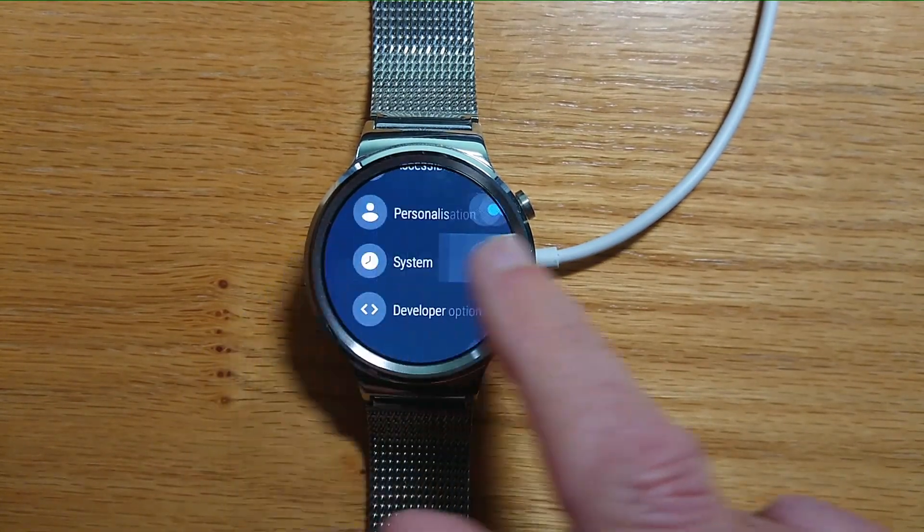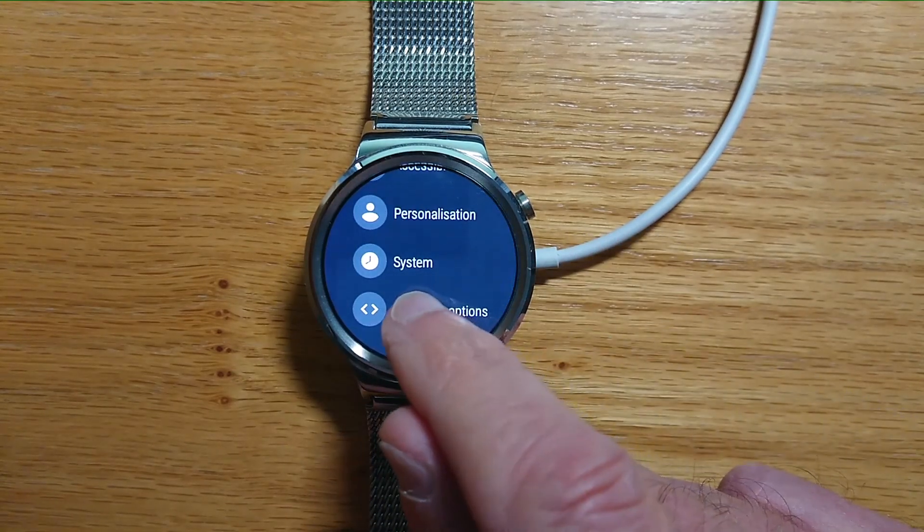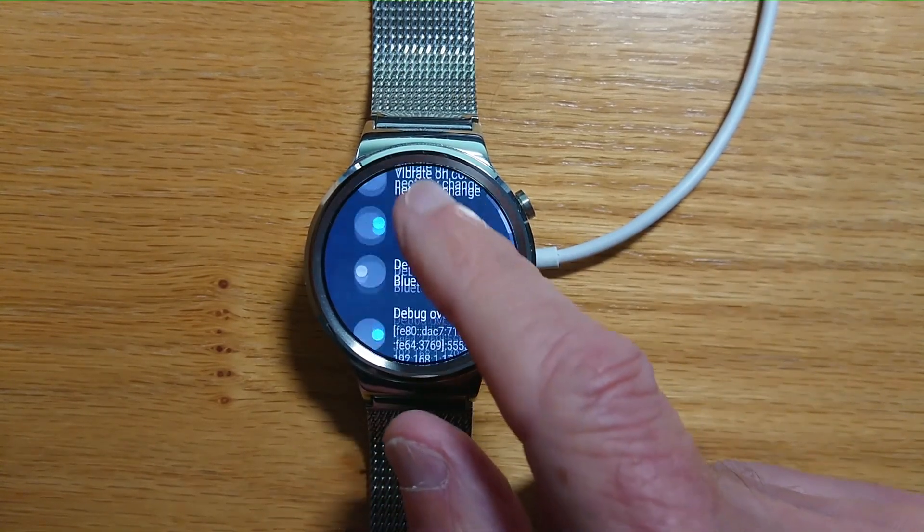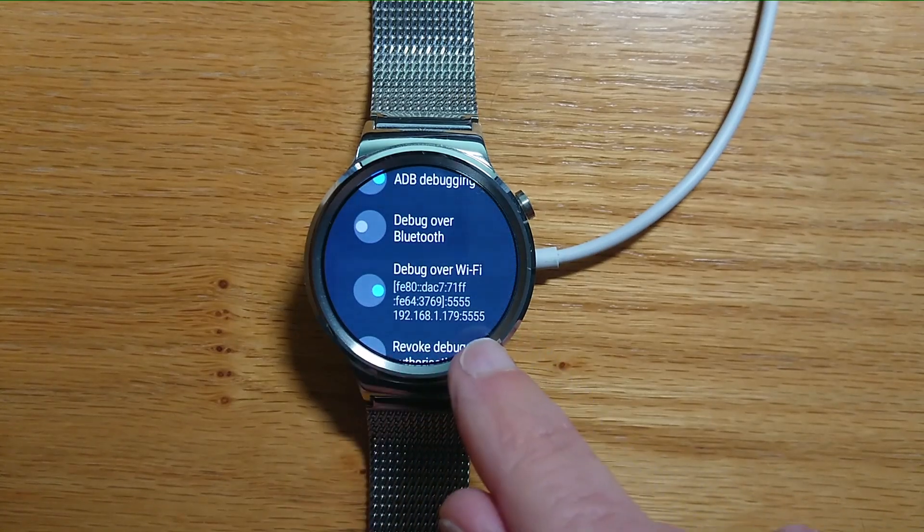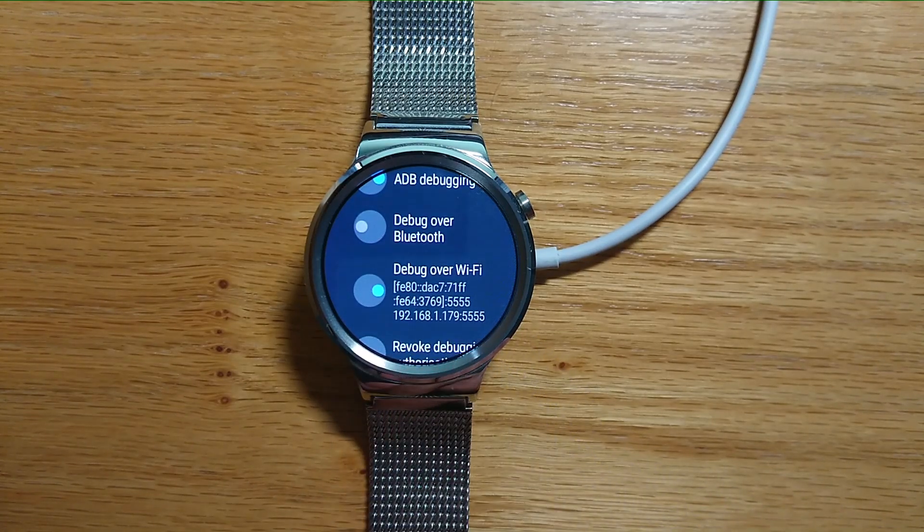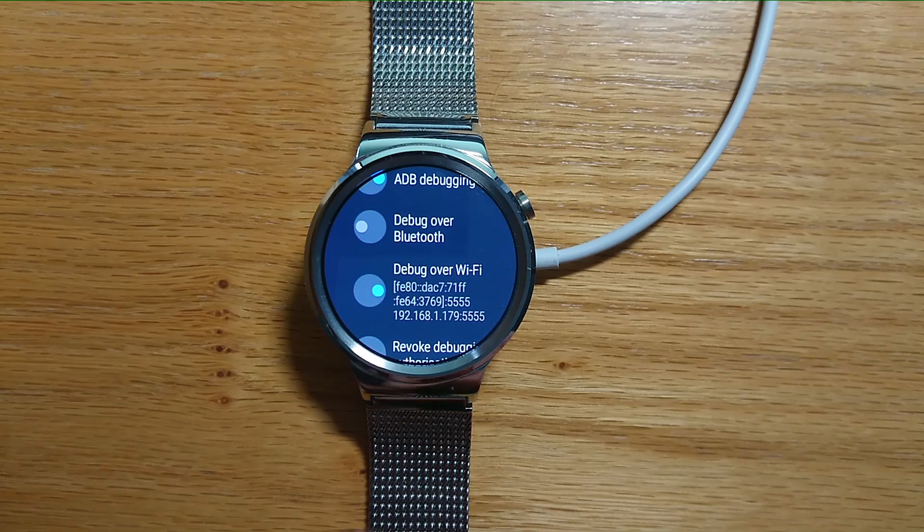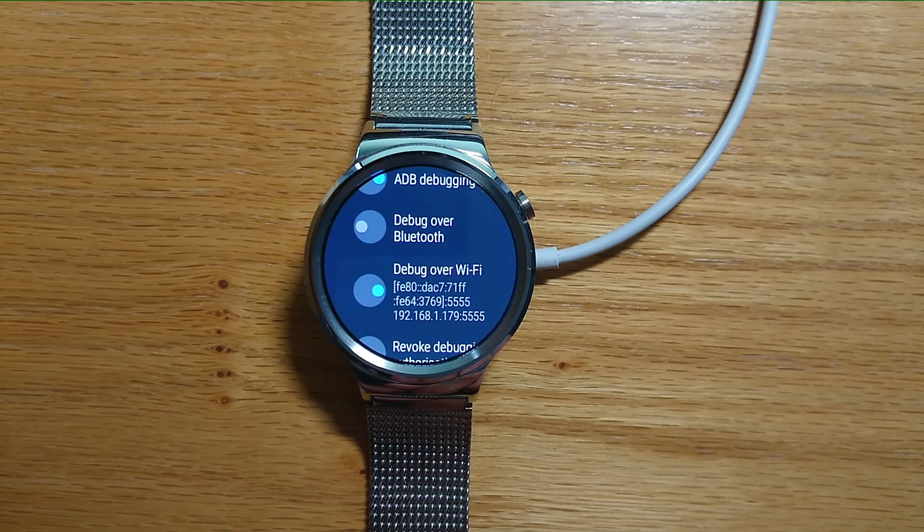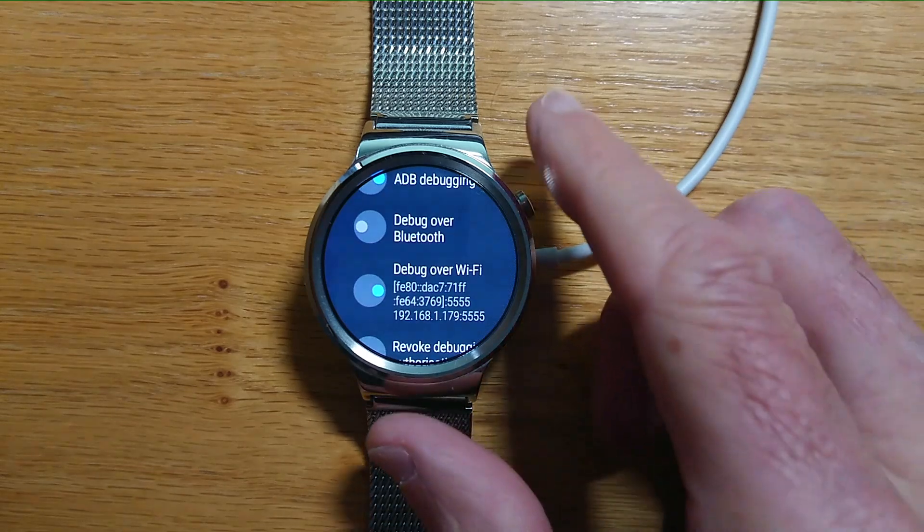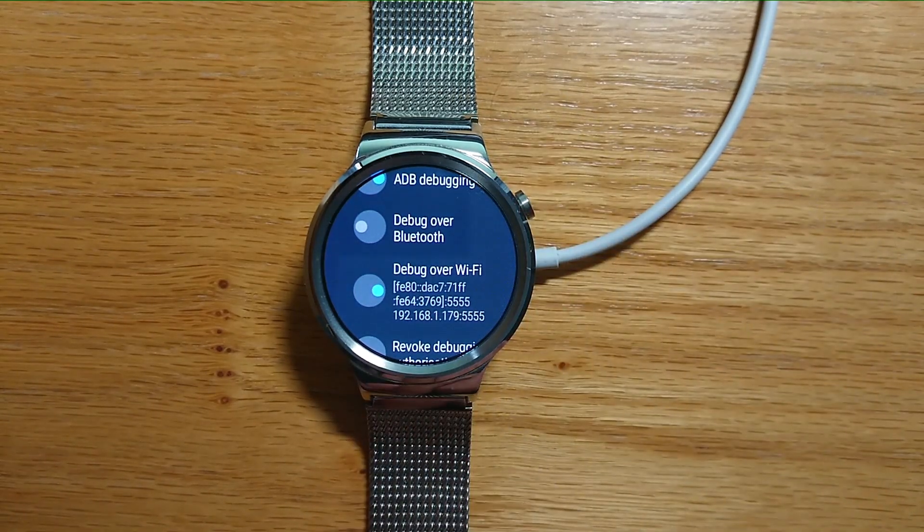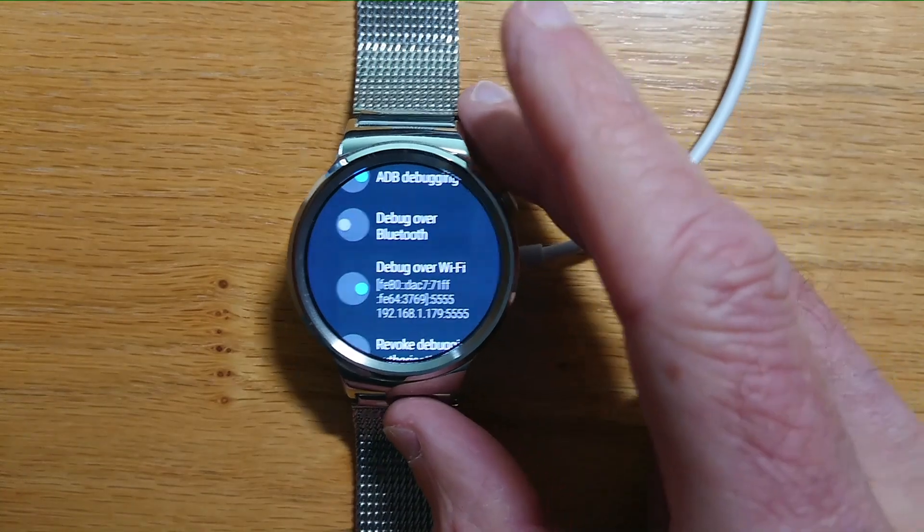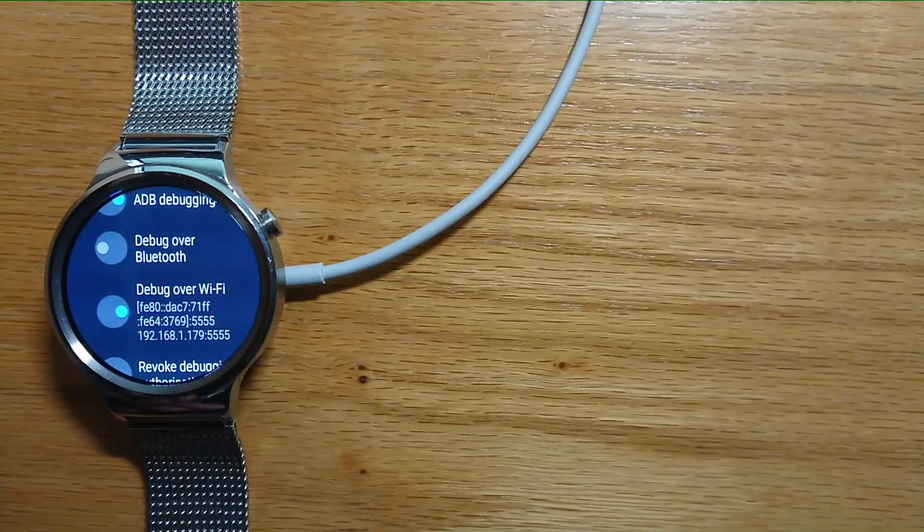Then just come out of Developer Options and go back in, and you'll see there that it's found the IP address of the watch on my local network. We're going to need this IP address in a moment for WearInstaller. So 192.168.1.179—your IP address obviously will be different from that.